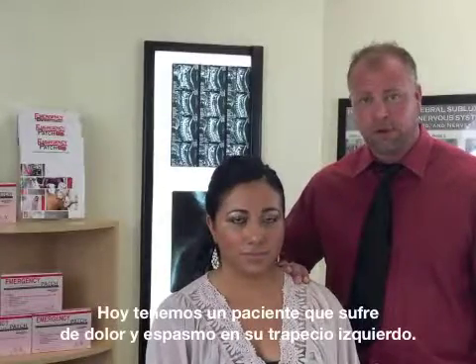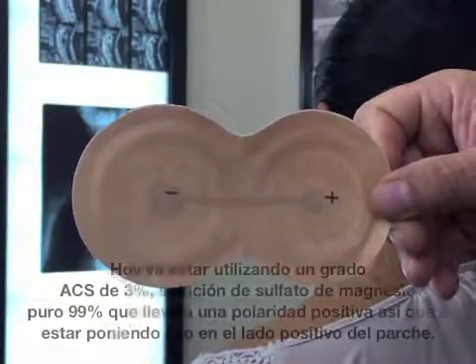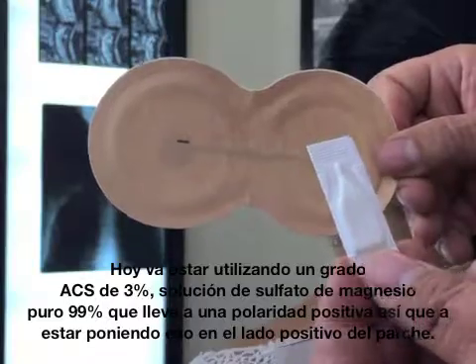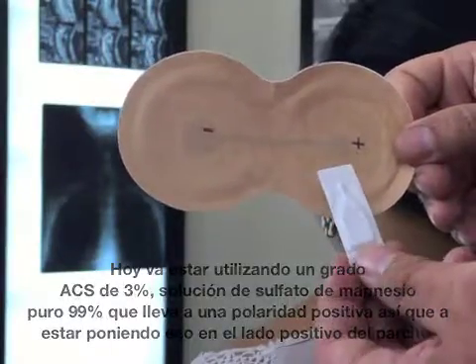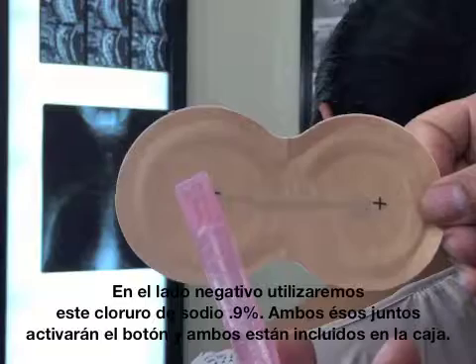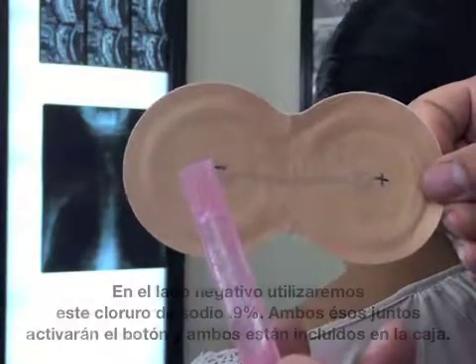Today we have a patient suffering from pain and spasm in her left trapezius. The Emergency Patch has a positive and negative side. Today we'll be utilizing a 3% ACS grade 99% pure magnesium sulfate solution, which carries a positive polarity, so we'll be putting that on the positive side of the pad. On the negative side we'll be using sodium chloride 0.9%. Both of those together will activate the pad, and they're both included in the box.